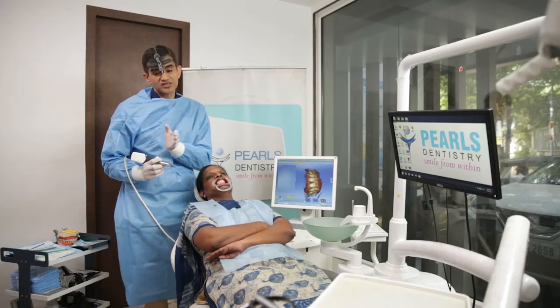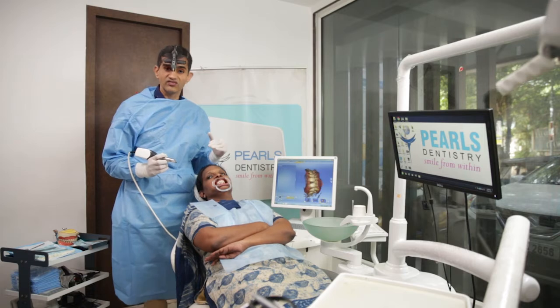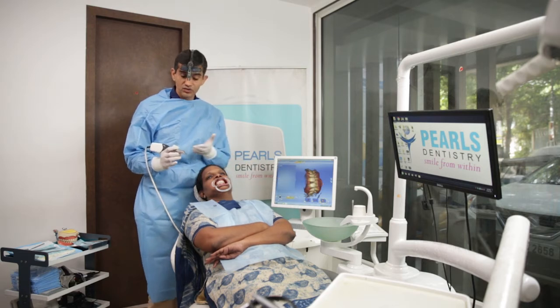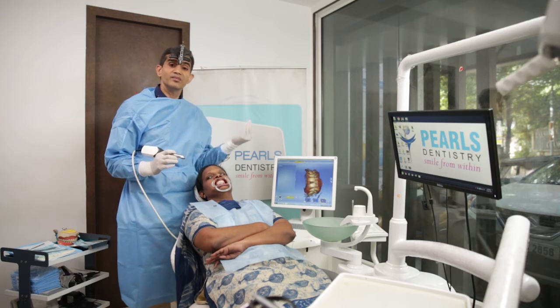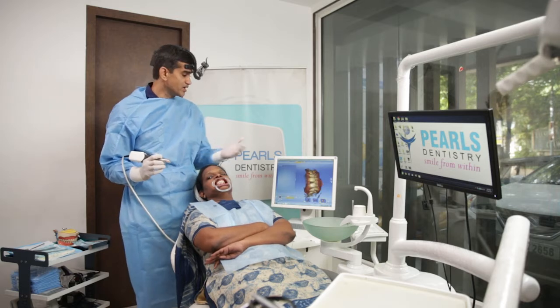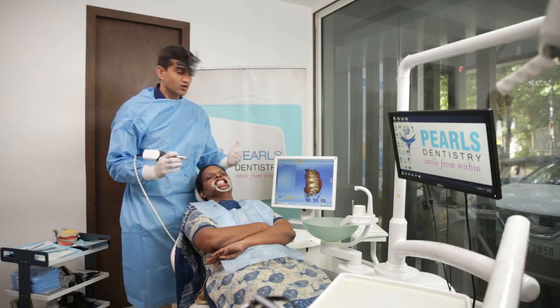CAD CAM in dentistry. CAD CAM stands for Computer Aided Design and Computer Aided Manufacturing. The first step is the digital impression, which we make using an intraoral scanner. Alternatively, we can make a manual measurement of the patient's tooth and use an extraoral scanner to make a similar model, like a scan of the model.